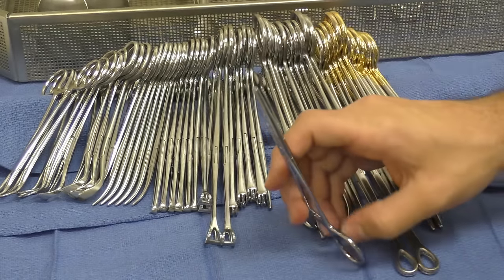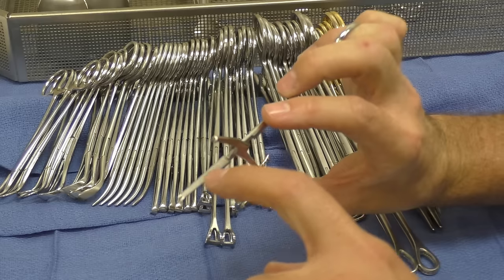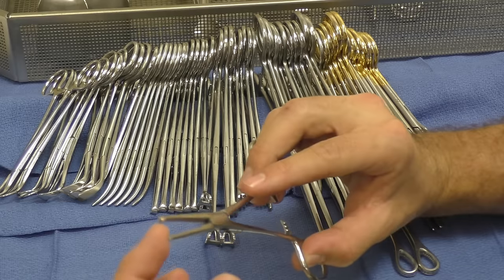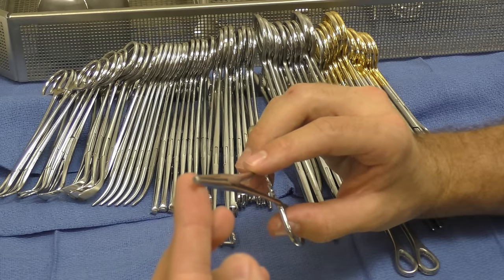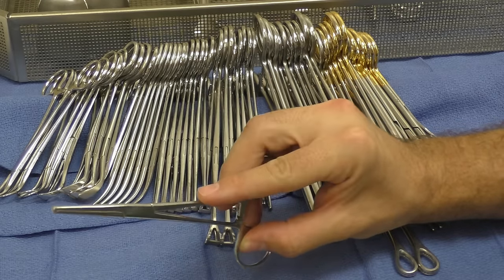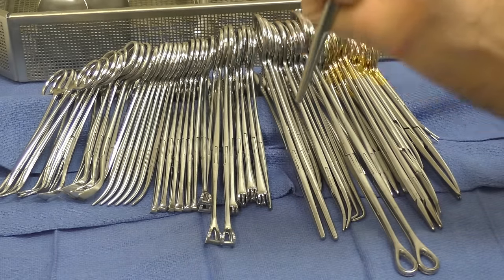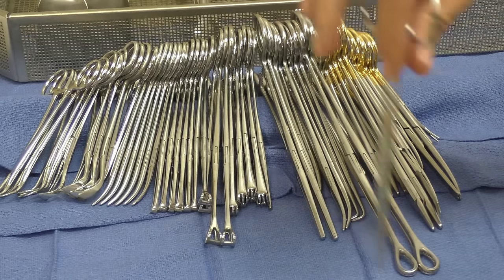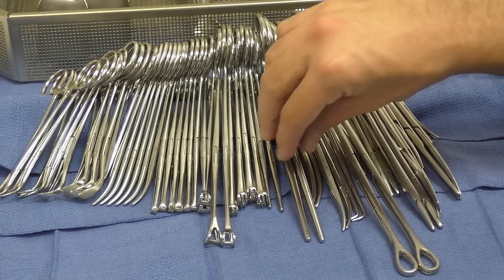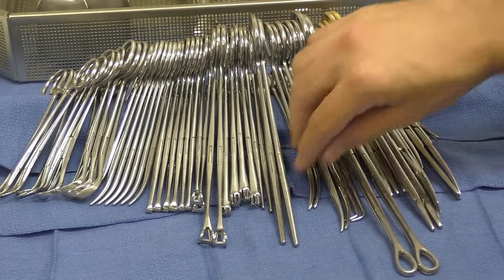Next up, we have the Coker here, or the Rochester Ochsner Coker. As you can see, the inside of the clamp is similar to a Kelly, where it just has these serrations on the inside of the clamp, but it has these two little teeth here at the end, these spikes. And this is really used to grasp onto tough tissue and really pull up on that tissue to get it out of the way, get a better view for the surgeon, that type of stuff. Again, we have a 6 and an 8 inch here. And a lot of these instruments come in all different lengths as well.